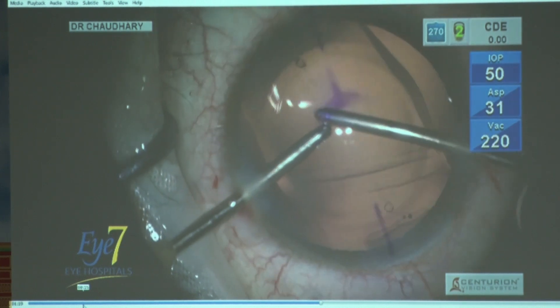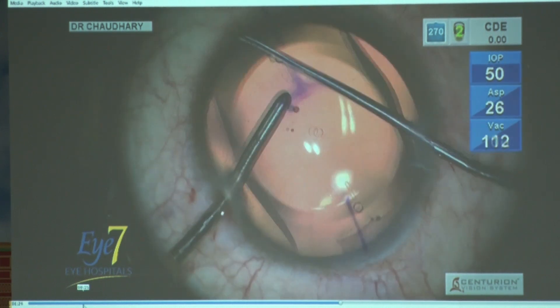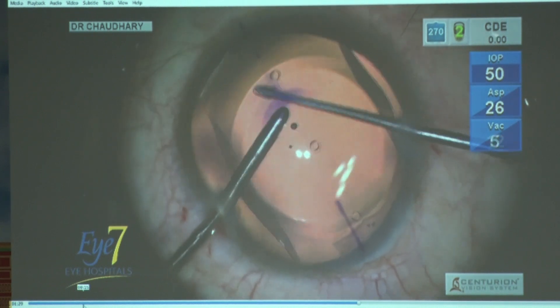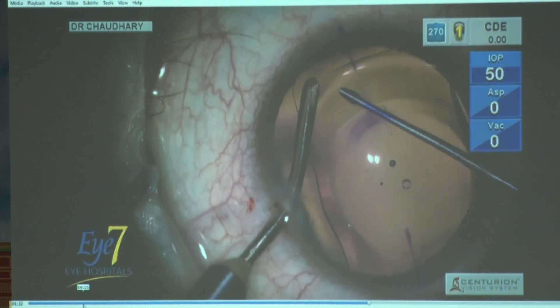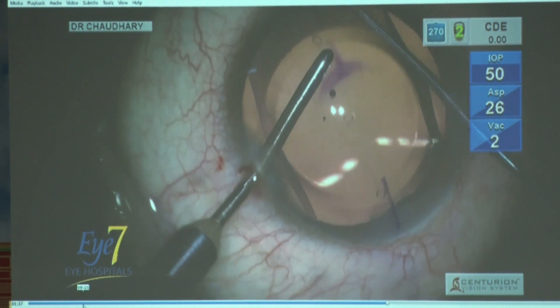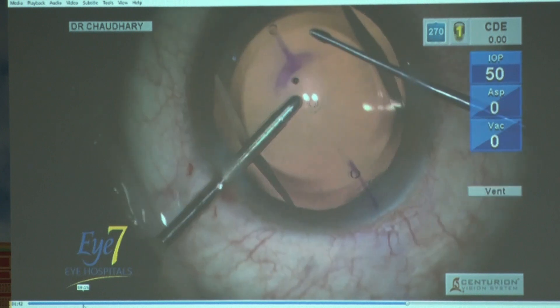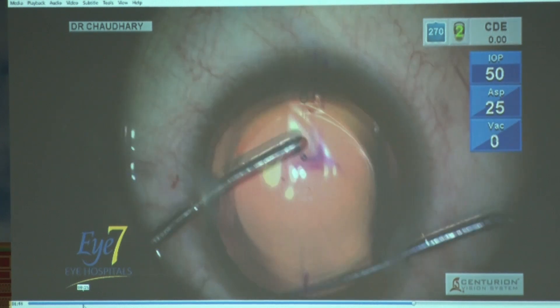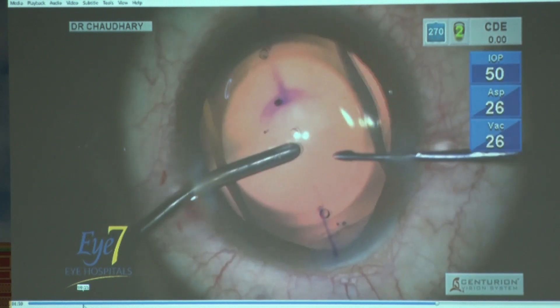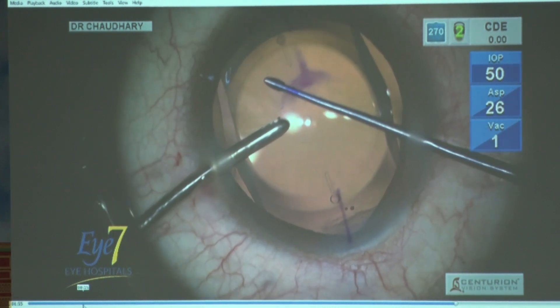Now putting it into place. First thing is that you bring this lens along the axis at which you are going to implant it. Once at the axis, it is matching with the external marking points. Then you tuck in one haptic, the second haptic, the third haptic, and then reassess that your lens is still in position. Before you go in for the last haptic, your lens should be exactly in position, and then tuck in the last haptic and the job is done.